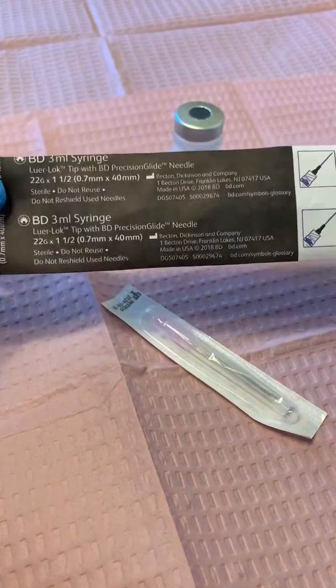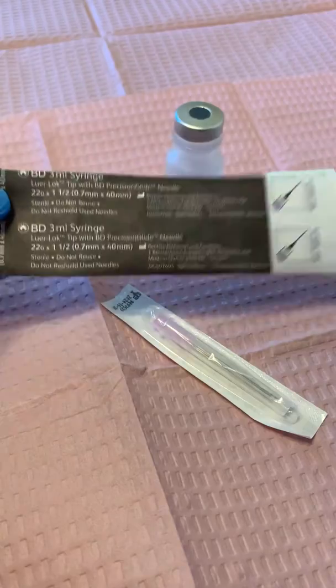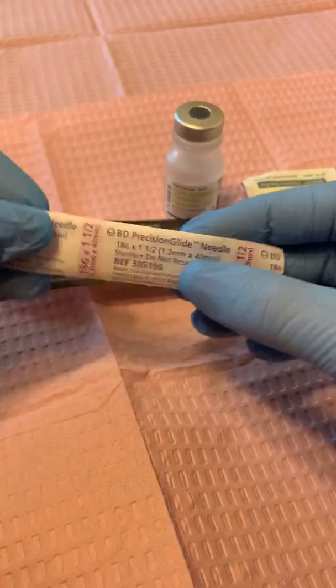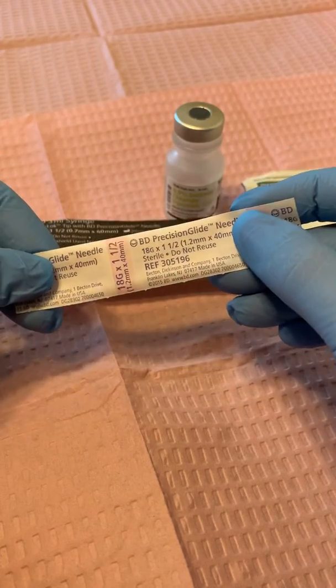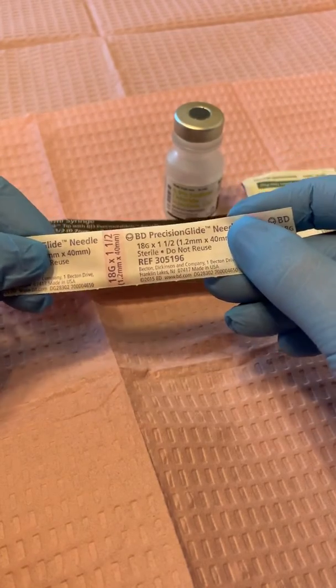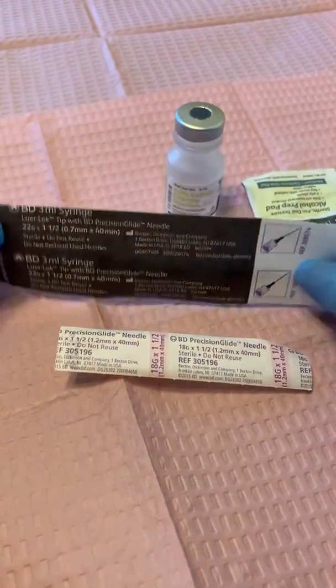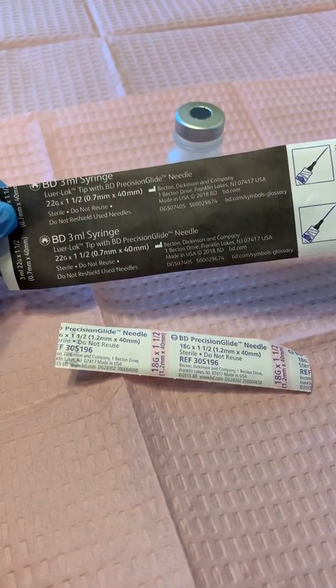When I draw up these types of syringes, I like to use an 18 gauge needle to draw up the medication. It makes it faster, less bubbles, and that way I can change out the needle for the needle that I will use to inject the patient with.